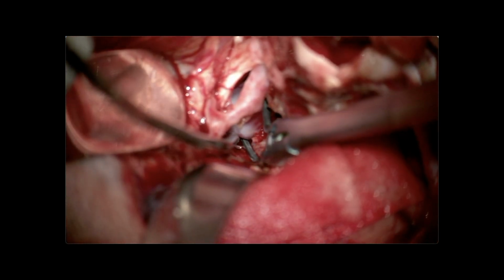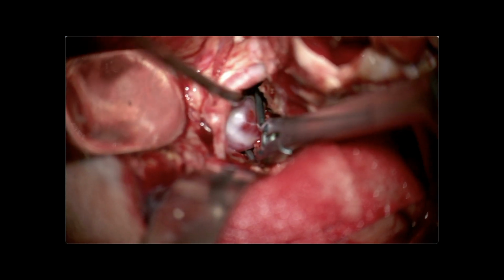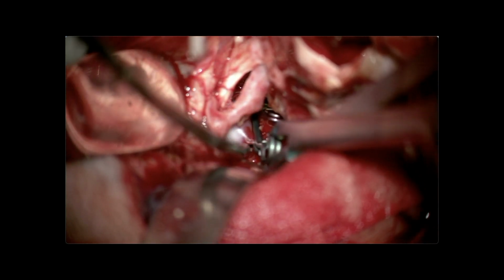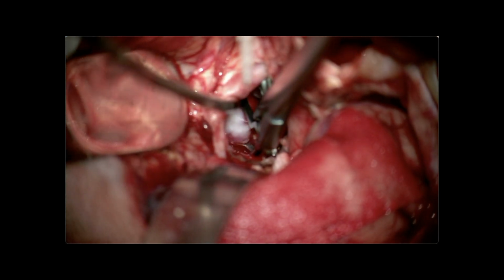Dissection of the aneurysm neck and clipping with a curved clip is performed. Clipping should be performed only after evaluating the course of the perforating arteries. An additional clip is applied.